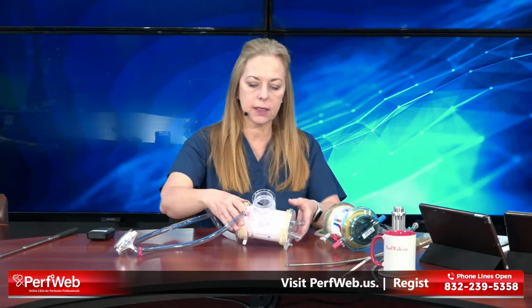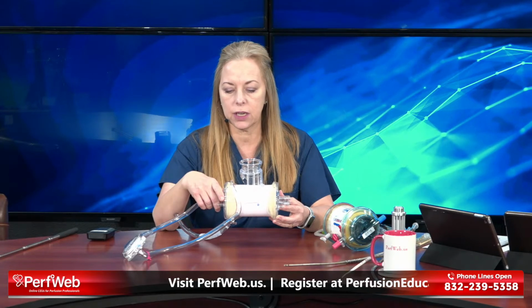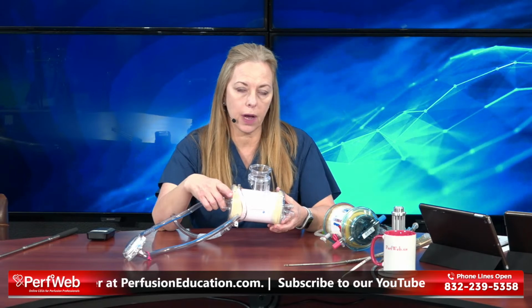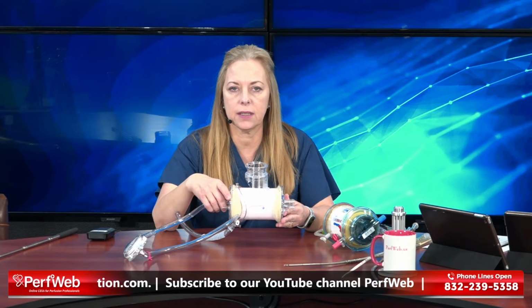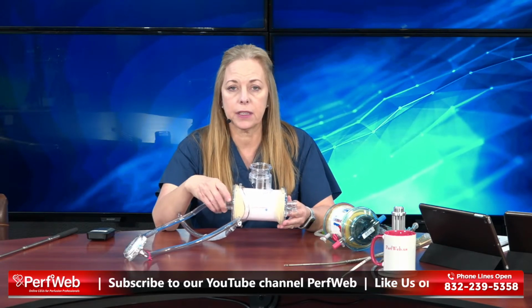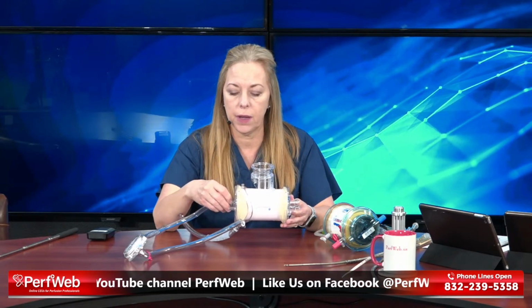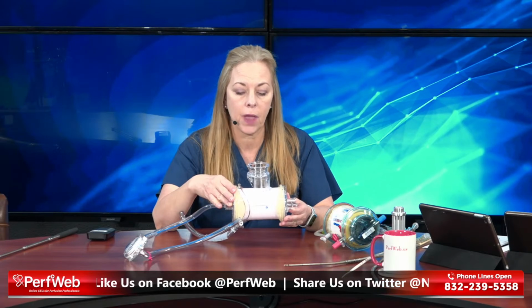I'll start first with this oxygenator, also made by LivaNova. This is the Inspire oxygenator. Now, this one is made of polypropylene, and it is what we like to call our short-term oxygenator, although during COVID, when we had so many patients and supplies weren't available as quickly as we needed them, just due to manufacturing trying to keep up, we found that this oxygenator really isn't short term. It lasts quite a long time.